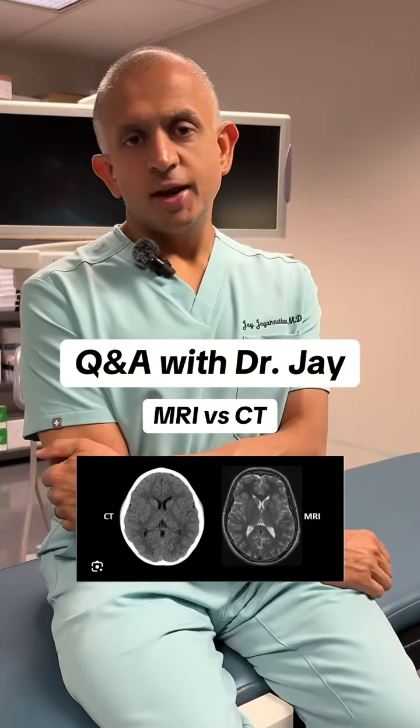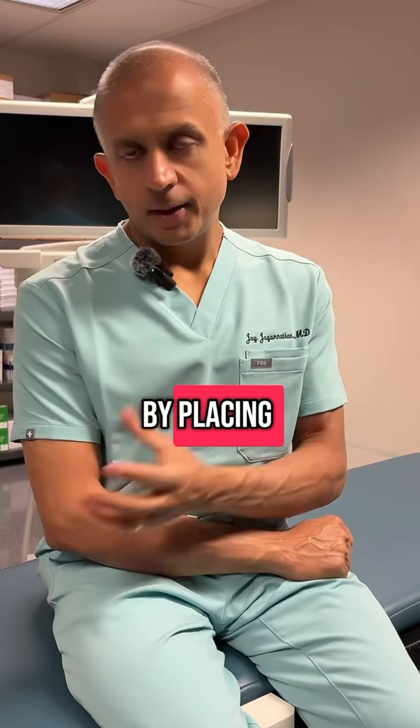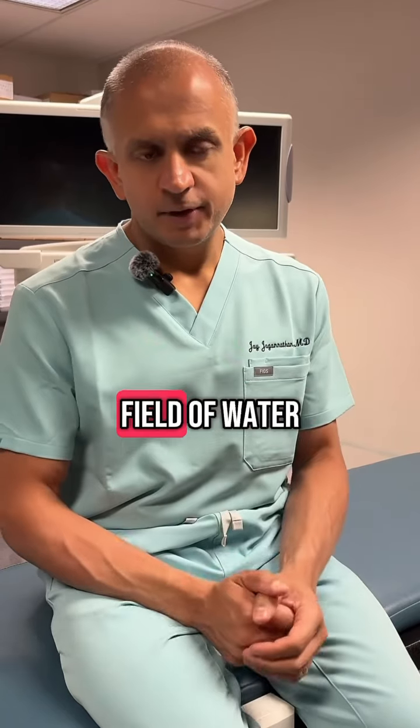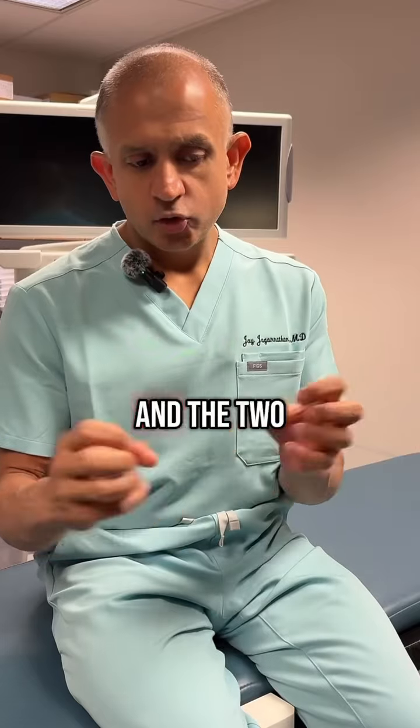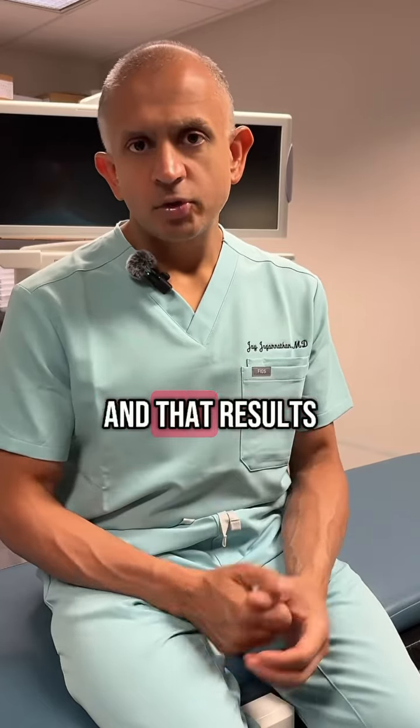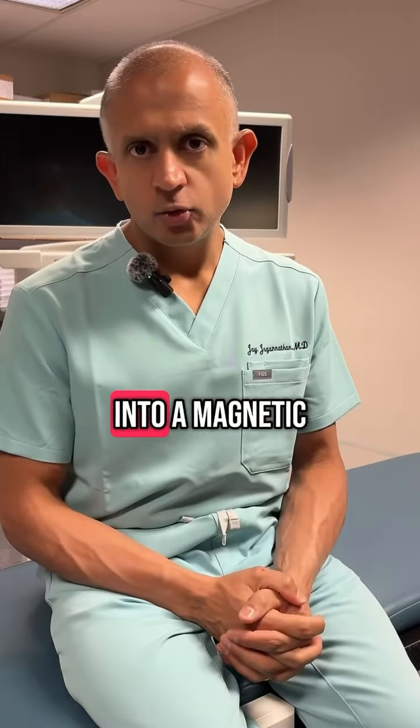So MRI versus CT. An MRI is done by placing the patient in a giant magnet. And as you know, most of our bodies are composed of water. So when water is placed in a magnetic field, because of the oxygen and the two hydrogen atoms there, it tends to form kind of a dipole or charged particle. And that results in different responsivities in a magnetic field.